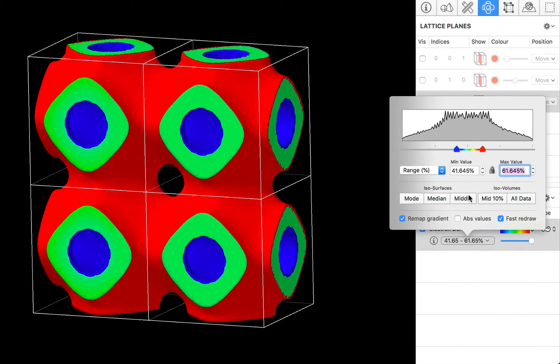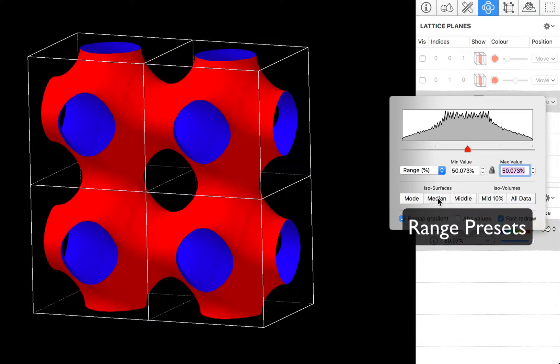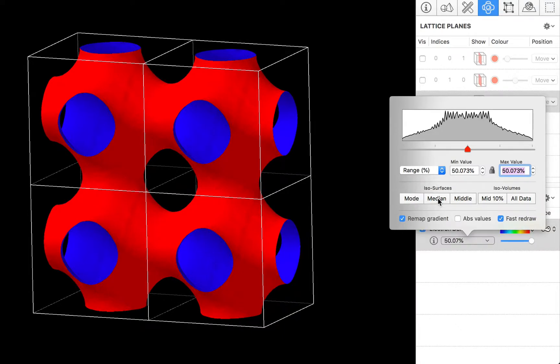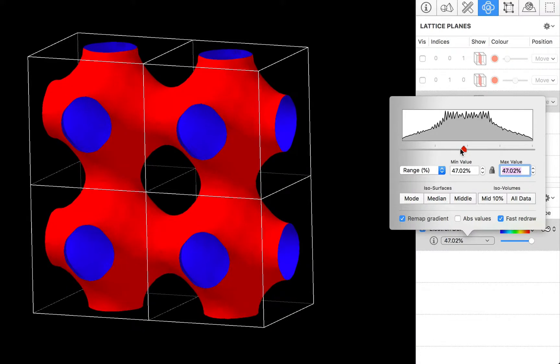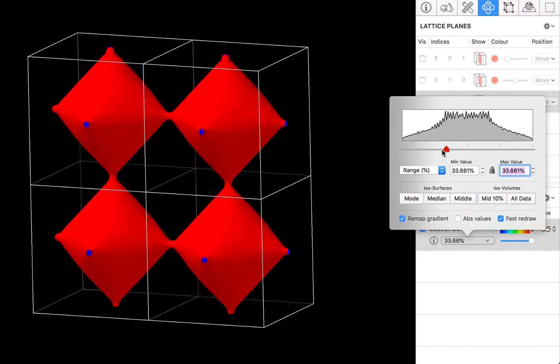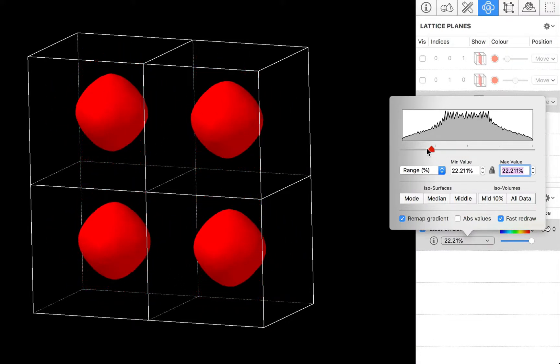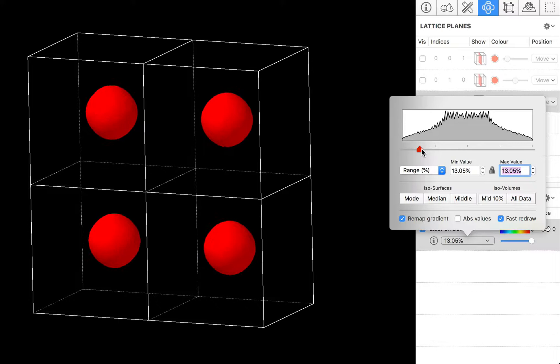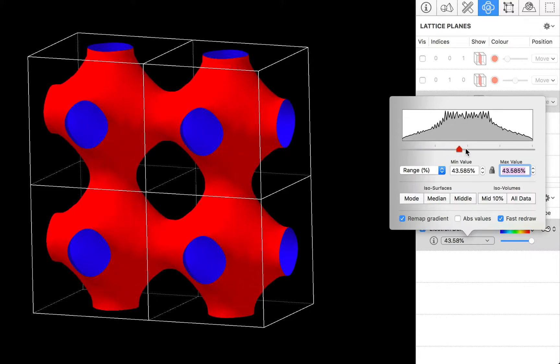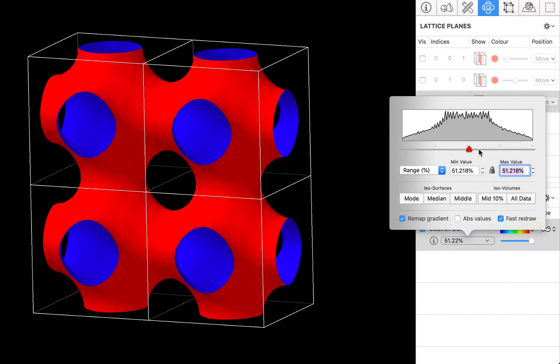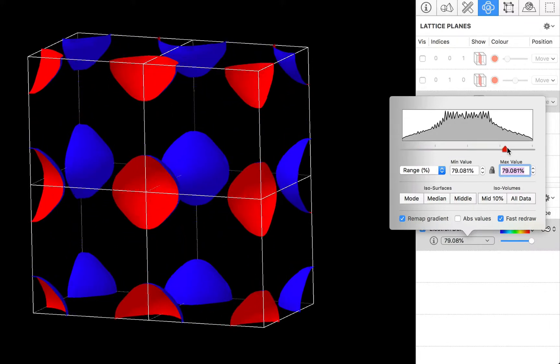At the bottom we have some presets. So we can look at the median. Now notice that here we are visualizing an ISO surface. The minimum and maximum values are the same. So for the ISO surface we just have a single slider bar thumb which allows us to scroll all the way through the full data range.